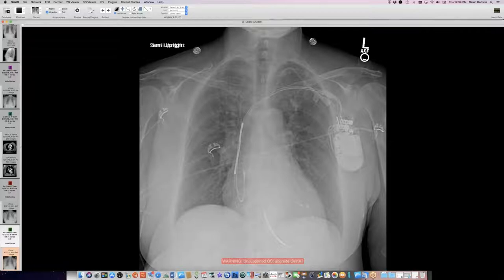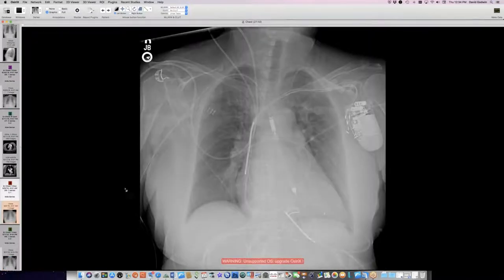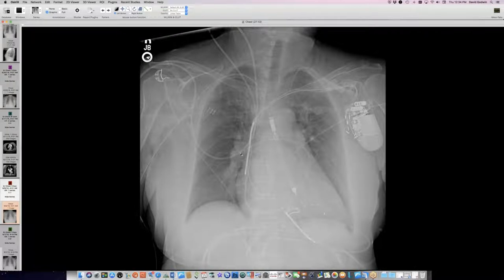Here's a woman who had heart failure — she's got a defibrillator in place and eventually acquired a Swan-Ganz catheter. A catheter is in place going to the right hilum. In the old days, people used to park these catheter tips out clearly in the lung, in the hilum. These days, they seem to park the tips back in the mediastinum most of the time. Do Swan-Ganz catheters typically extend into the lung or are they kept in the mediastinum at your places? Usually more central.